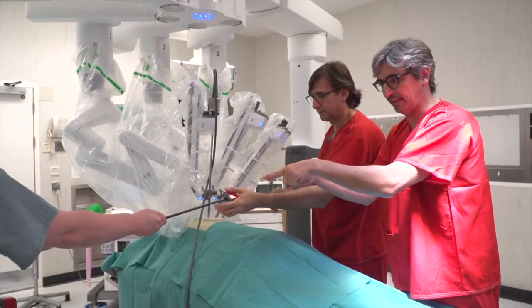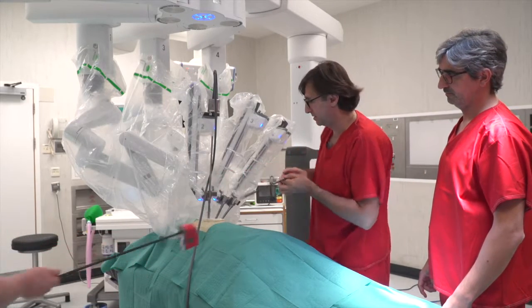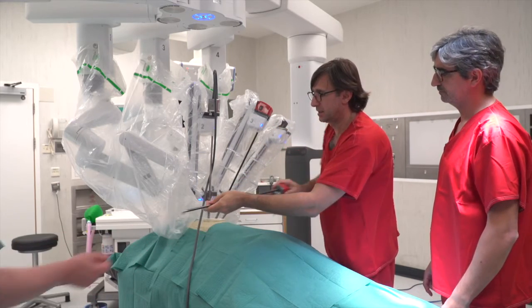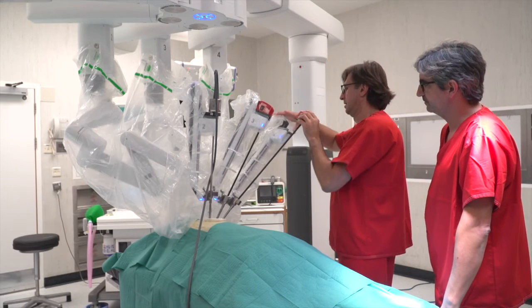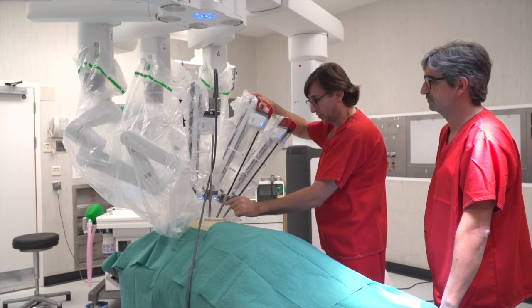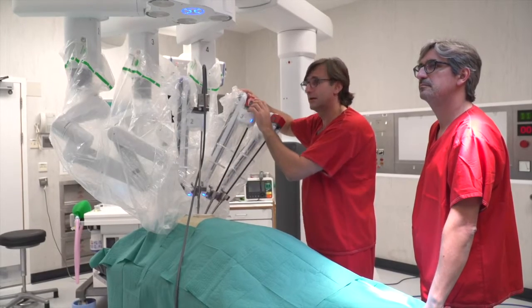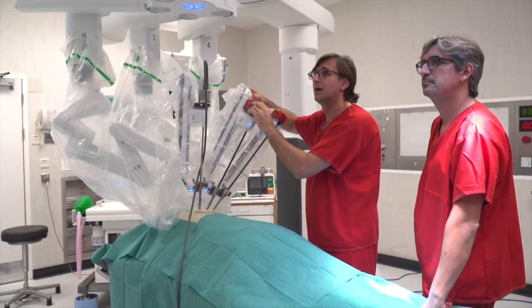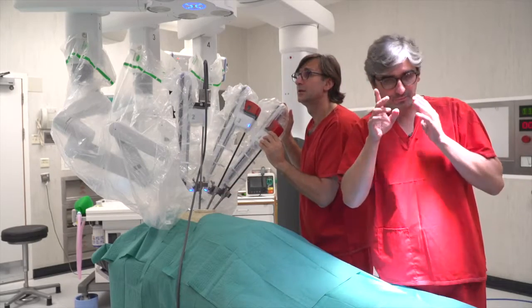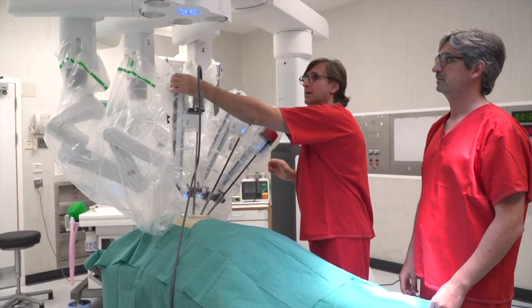My left arm is a pro grasp, arm number three. And the right arm is the Maryland dissector. You also use the direct vision for positioning — it's important, the screen and the direct vision. Because you have a utility incision, so you can see through the incision to put the arms. And then you are ready to go.